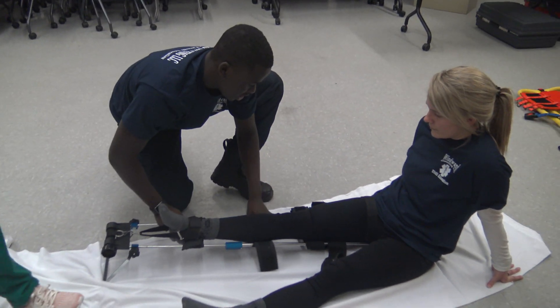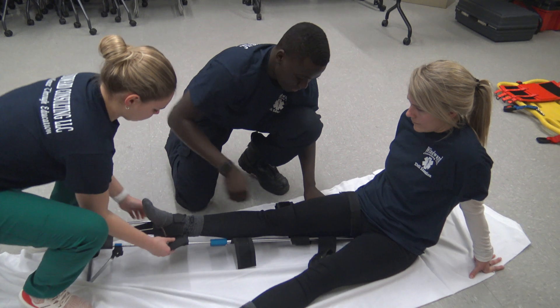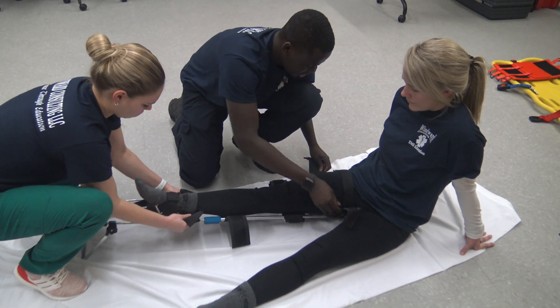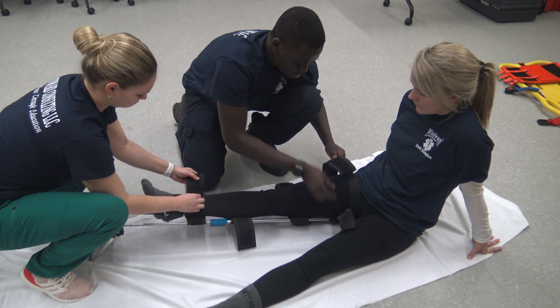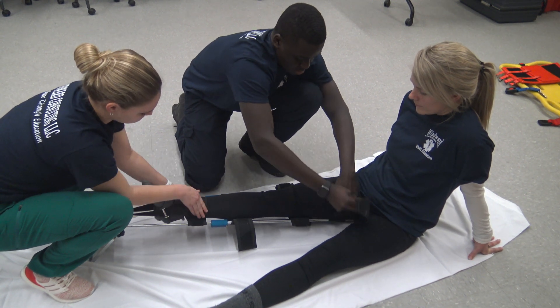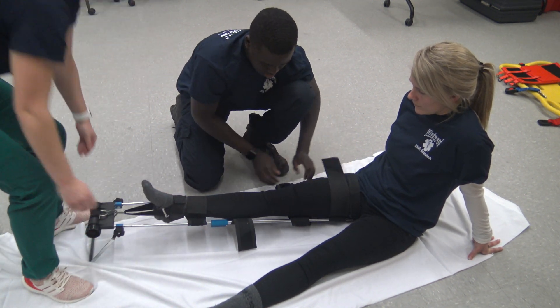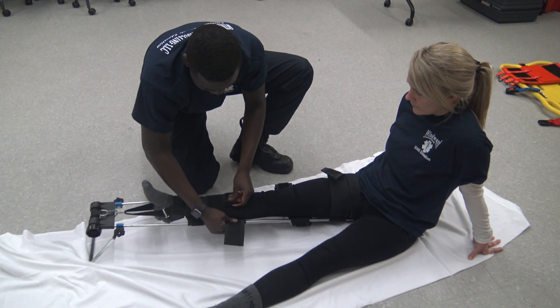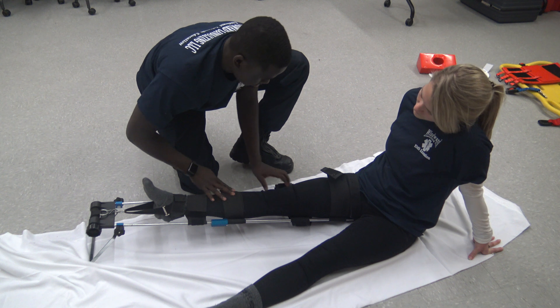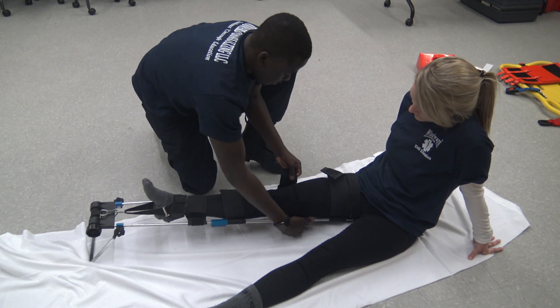Now I'm going to properly secure all the straps. Never put any straps on the injury site, but I'm going to make sure there's one strap above and below the injury site. Never put any straps on any joints. Palpate for the knee.